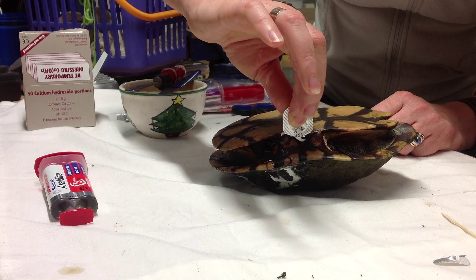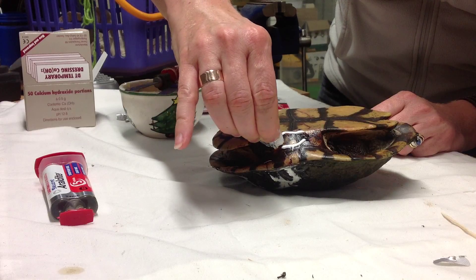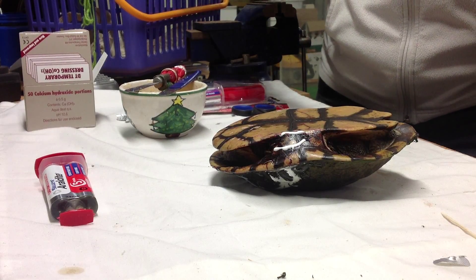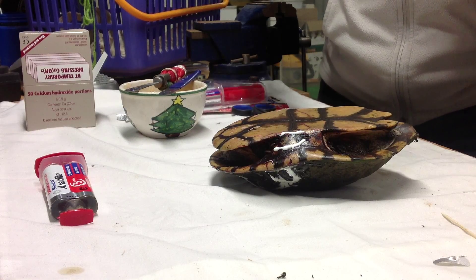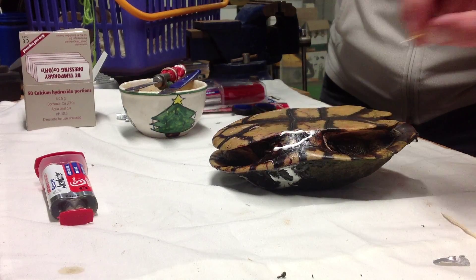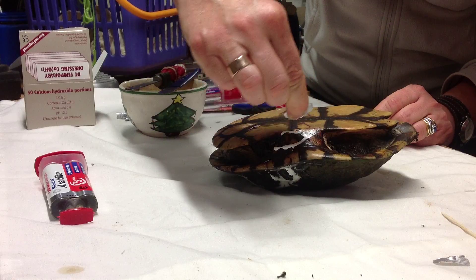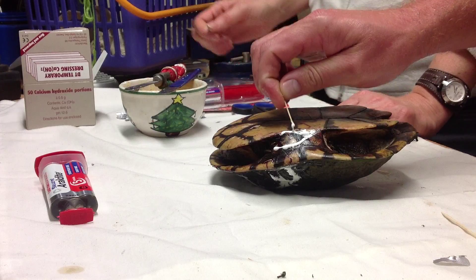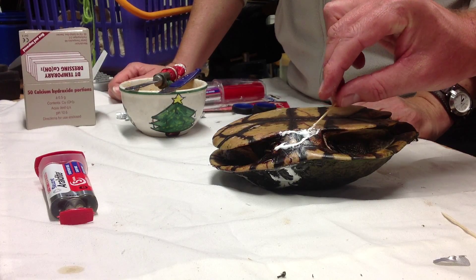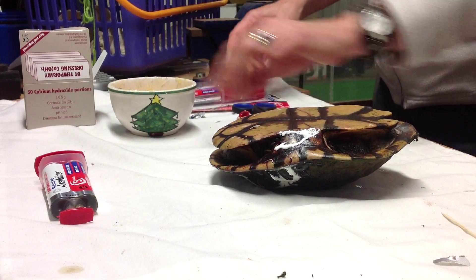Fortunately, we've been very lucky to work with some amazing vets. Howard Ralph was the first person who showed us this technique, and we're fortunate that Bungandor vets Michael and Stacey — and others at Bungandor — have taken this on as well. That's just the first part of the denture post. There's quite a big crack in here, so we'll probably put another one inside to get it right. I think we've probably got just enough in there — it's probably just sealed.